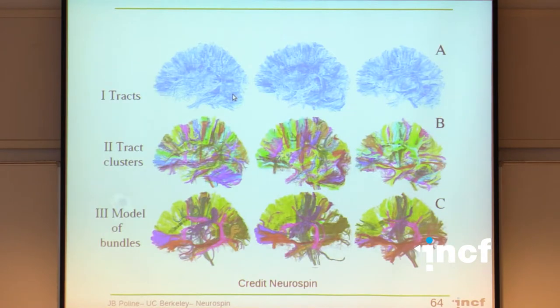And then you have the problem that you have also with T1. How do you average those things? How do you construct something which is like an average population? That's the same sort of problem. The big tracks you can probably map and average easily. The smaller tracks, where you have higher individual variability, we don't know what to do with that.